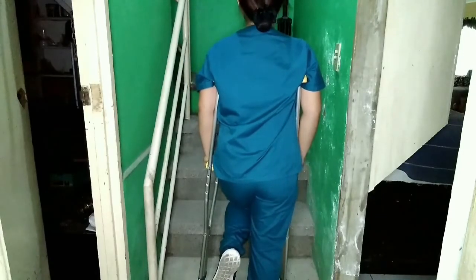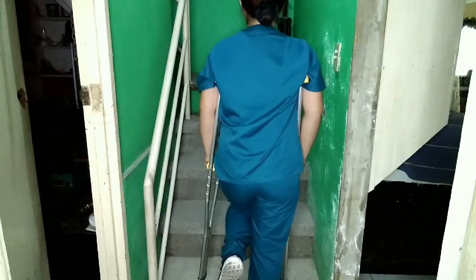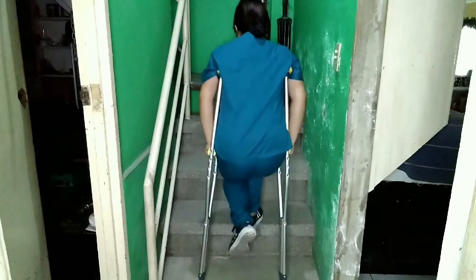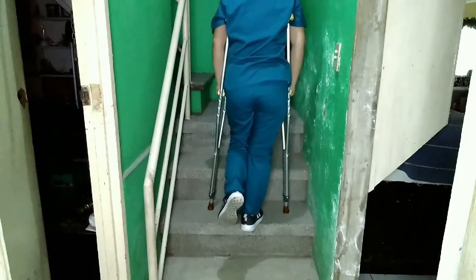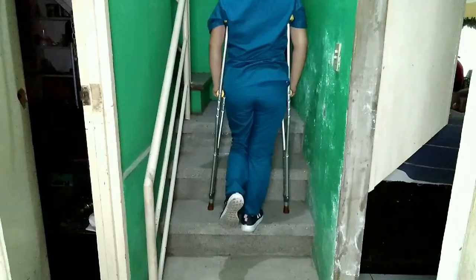Assume that this is the weak side of my leg and this is the strong side of my leg, then lift your body weight up onto the stairs. Repeat the sequence and observe your patient's level of balance and fatigue.